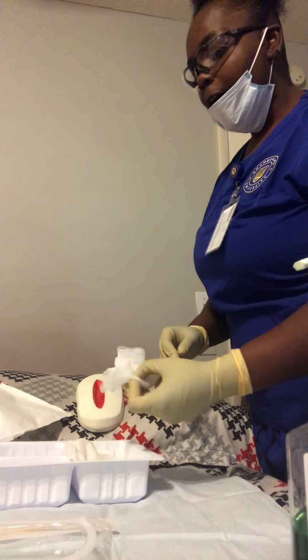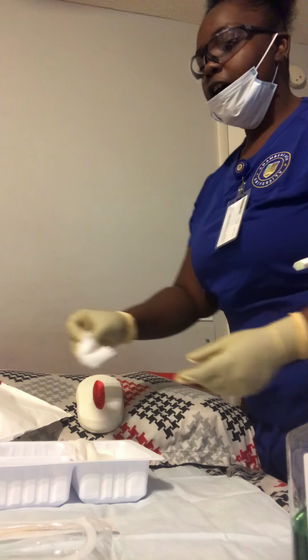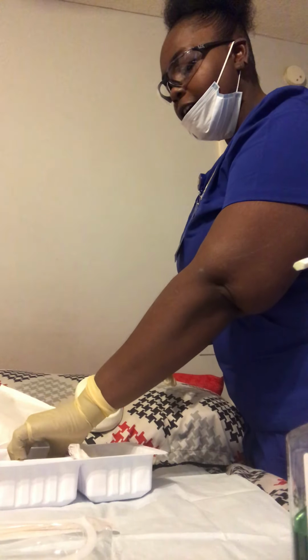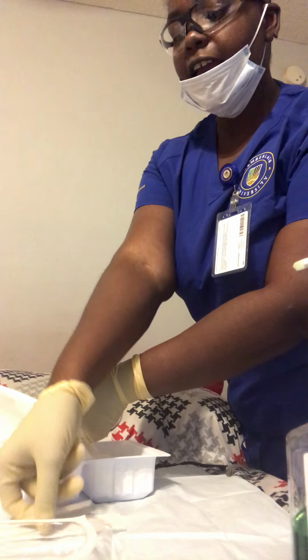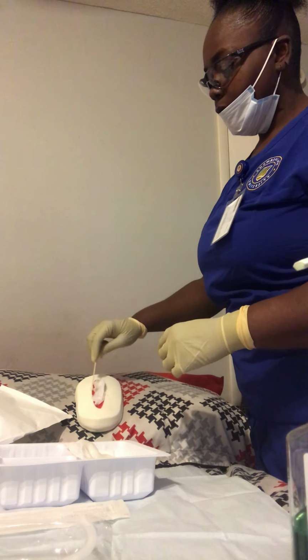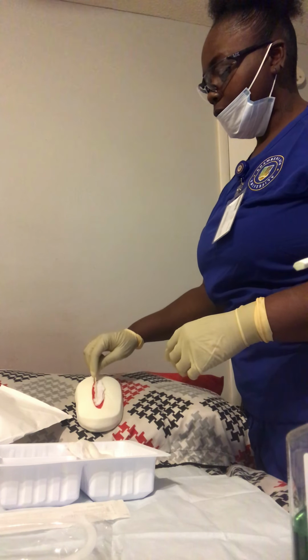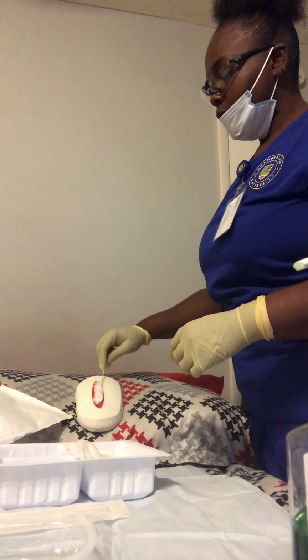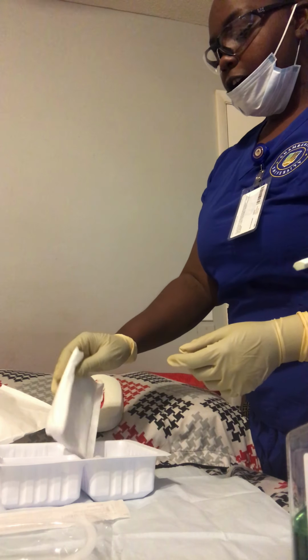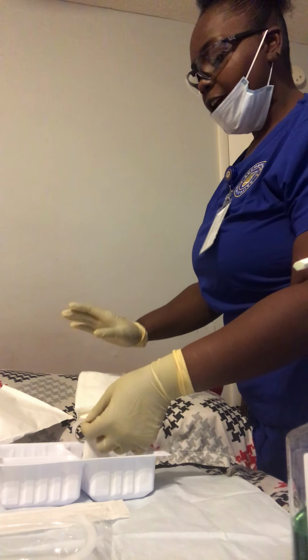I'm going to take a clean gauze and pat the wound dry. I'm going to discard that in the appropriate receptacle. And the next thing I'm going to do is to take my wet gauze and my cotton applicator and pack the wound. Discard in an appropriate receptacle. I'm going to take another gauze and place it over the wound, and I'm going to tape that down.